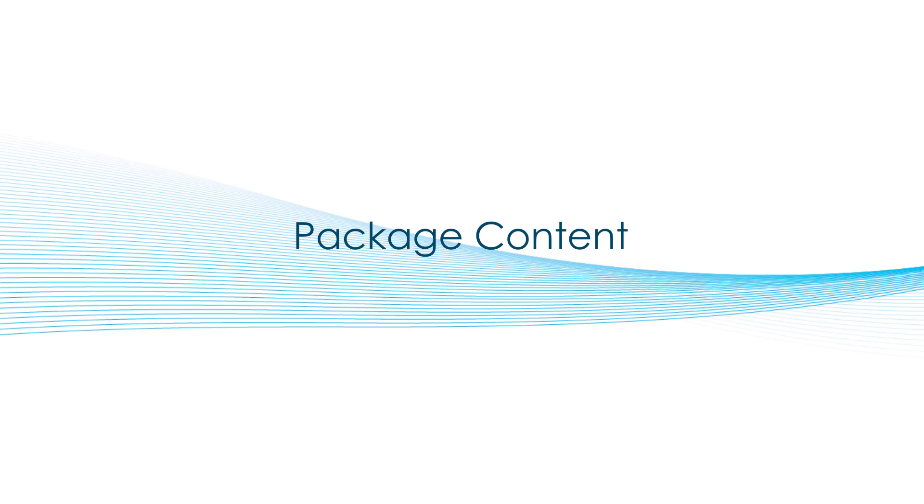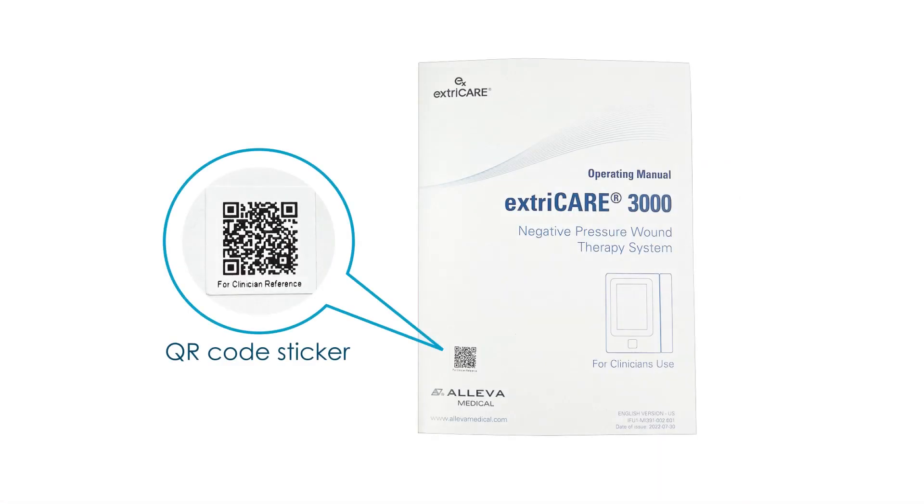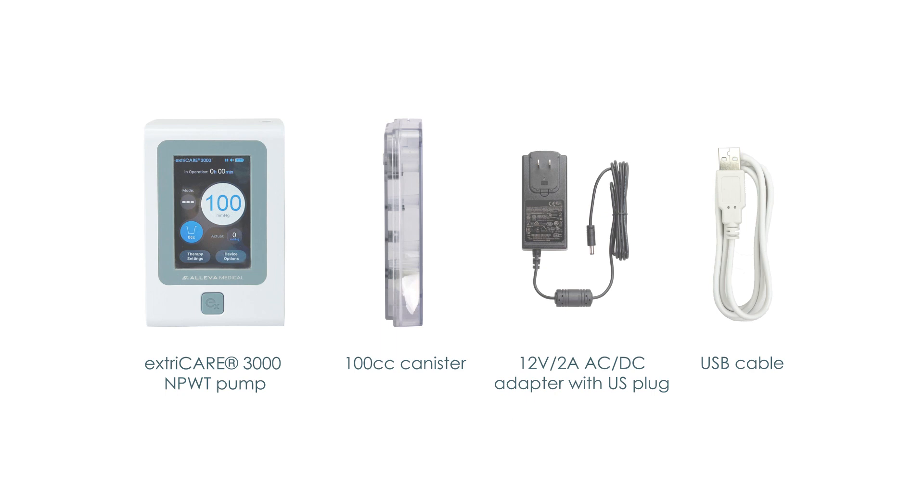Package Content. The ExtraCare 3000 unit comes in a commercial box. A Clinician IFU is provided inside the box. The Clinician IFU has a QR code sticker at the front that will link you to the clinician video you are watching now. The Patient IFU and Quick Guide might be provided separately by your institution. Included in the box is an ExtraCare 3000 unit, a 100 cubic centimeter collection canister, a power supply with a 10-foot cord, and a USB cable.